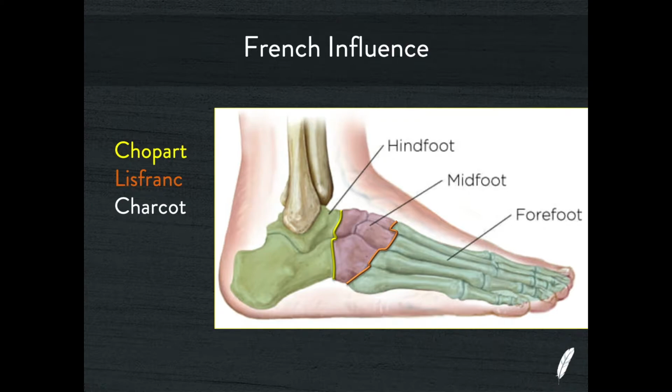So when we have an inversion injury to the ankle, when we have a traumatic event to the ankle joint, if the anterior talofibular ligament and the calcaneofibular ligament and the syndesmosis here survive that injury, sometimes the trauma will disrupt through this Chopart line. And this is a really common pattern, and it's really nice to understand with patients that have had inversion injuries.